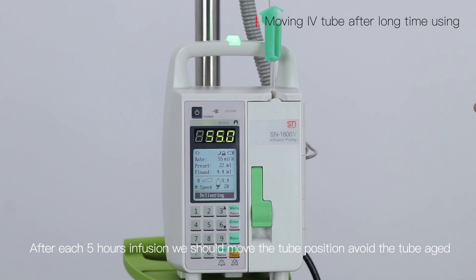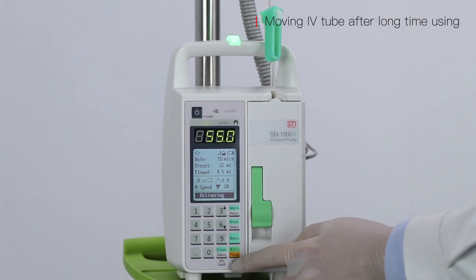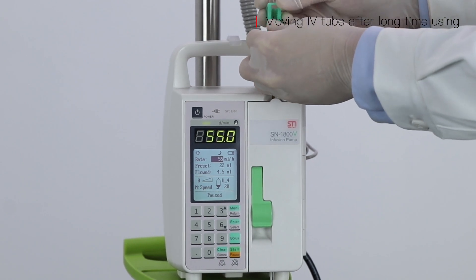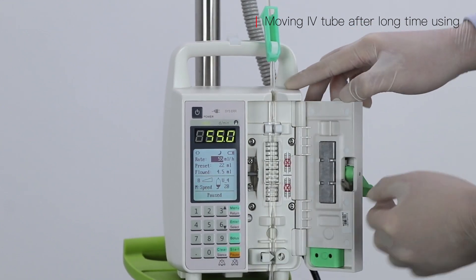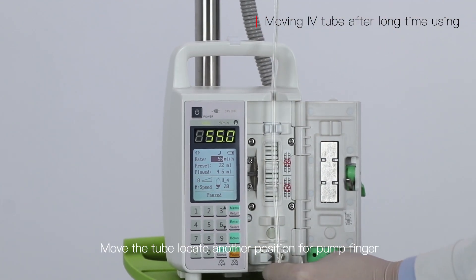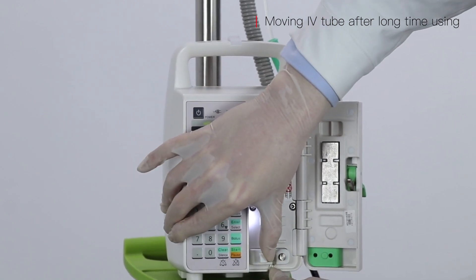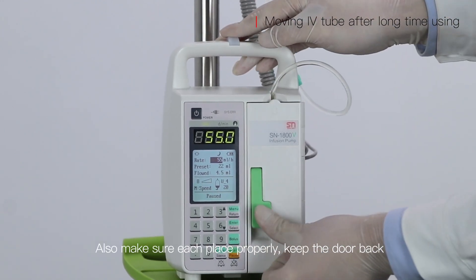After each 5 hours of infusion, we should move the tube position to avoid the tube aging. First stop the infusion and close the IV set, then open the door. Move the tube to another position along the pump finger. Make sure each part is placed properly and close the door.